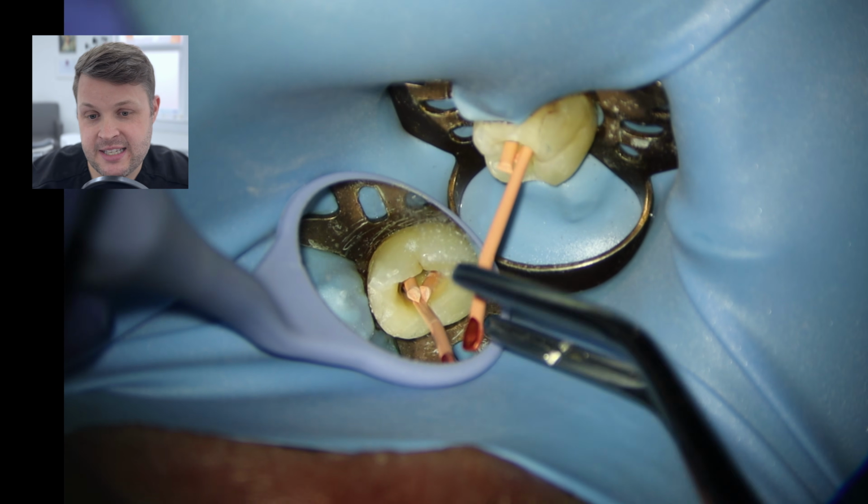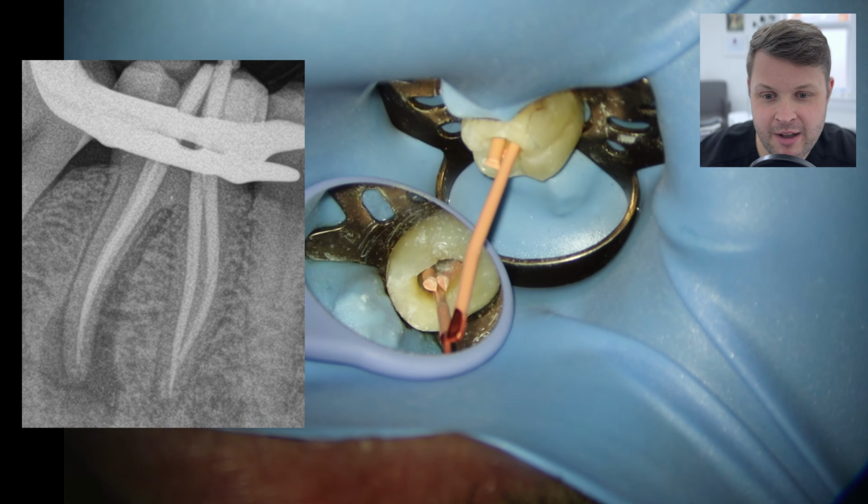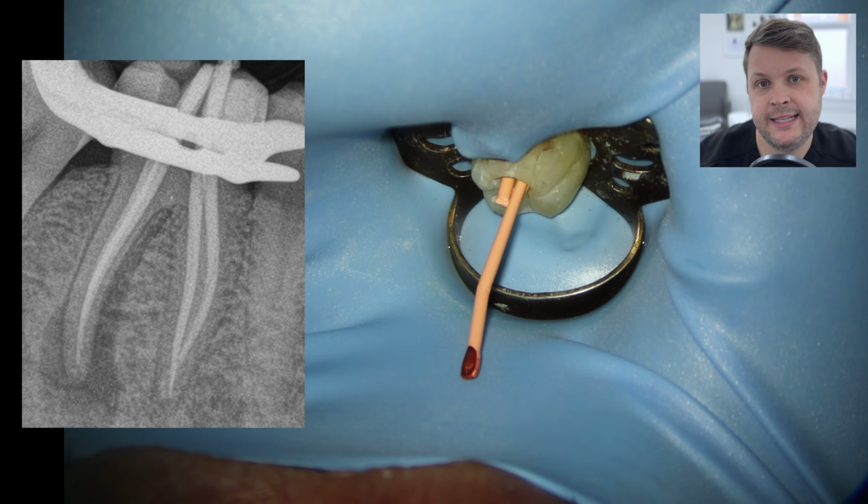And in this case, we look at the cone fit radiograph, and it looks really, really nice.